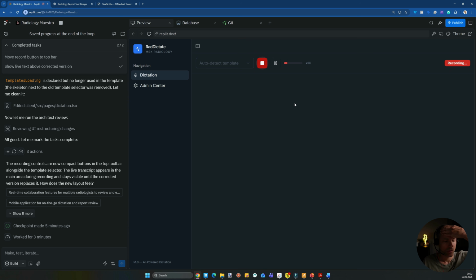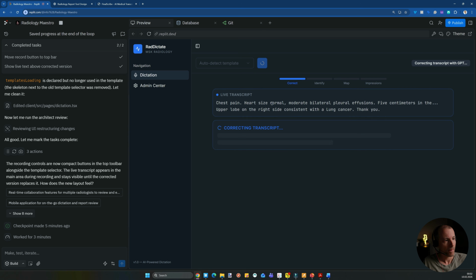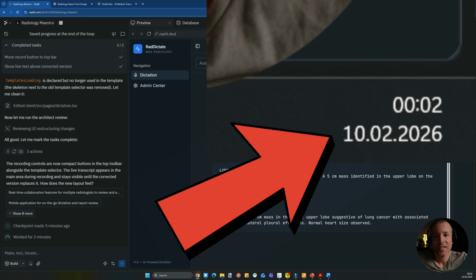Chest pain, heart size normal, moderate bilateral pleural effusions, 5 centimeter mass in the upper lobe on the right side, consistent with a lung cancer. Okay, I think that's good enough.